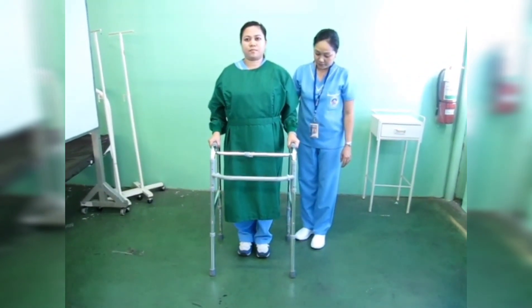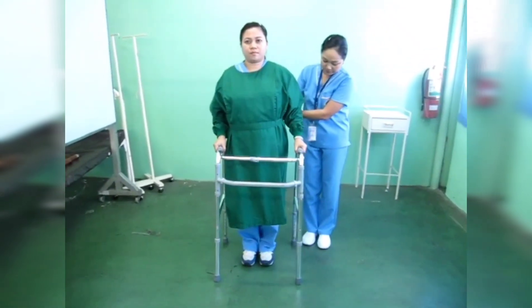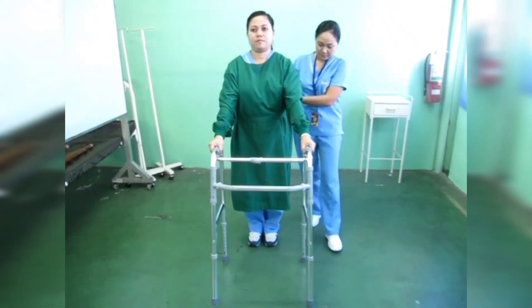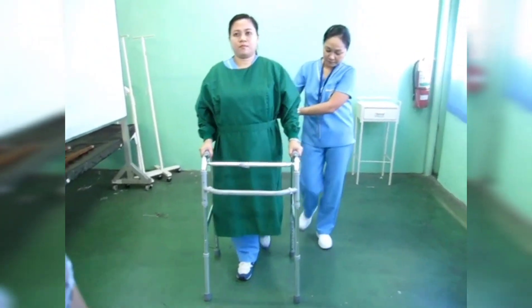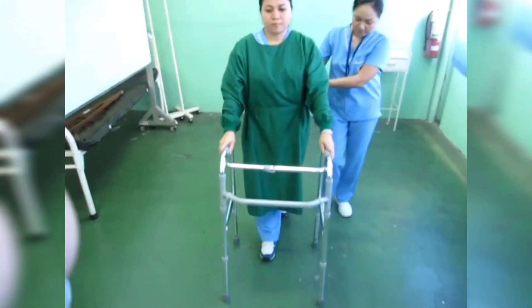The stepping pattern is repeated: walker, right foot, left foot — continuing in sequence to advance forward.